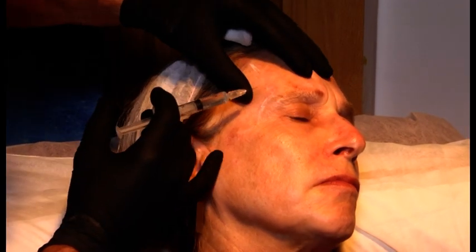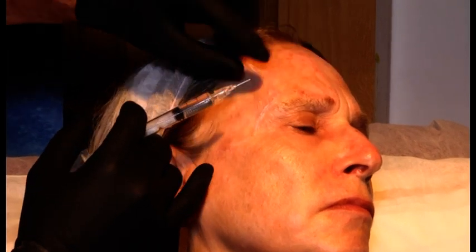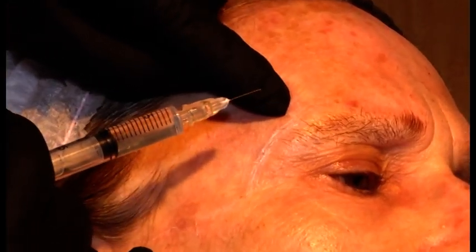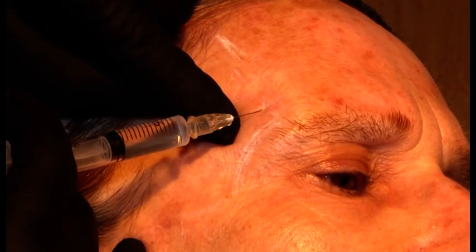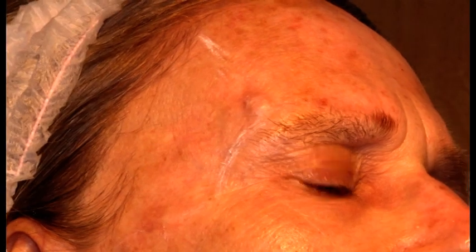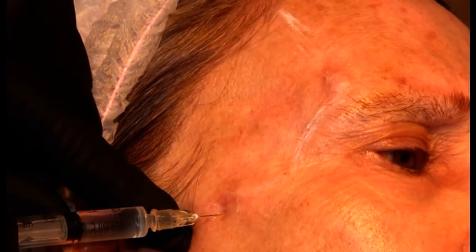Anesthesia, please. Thank you. And a dry swab. Where's the dry swab? Here. Before I anesthetize the entry point, I just want to make sure that there's no pulsation. So there's no pulsation. I can just put the needle in and inject a little bit of lidocaine. Over here, I will inject a little bit of lidocaine as well.